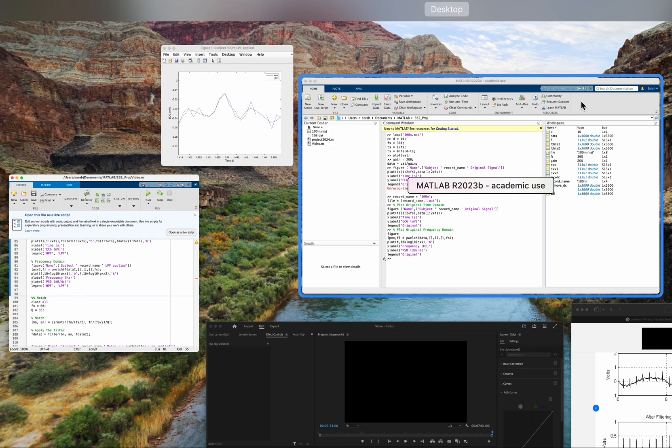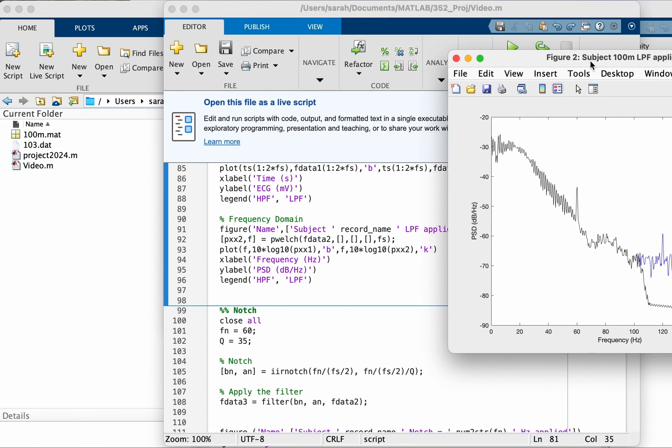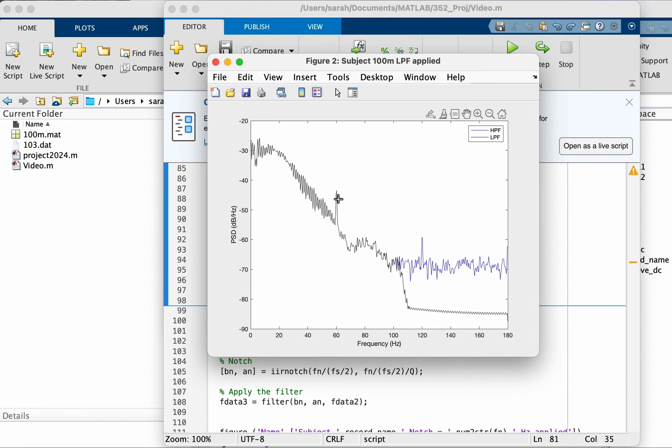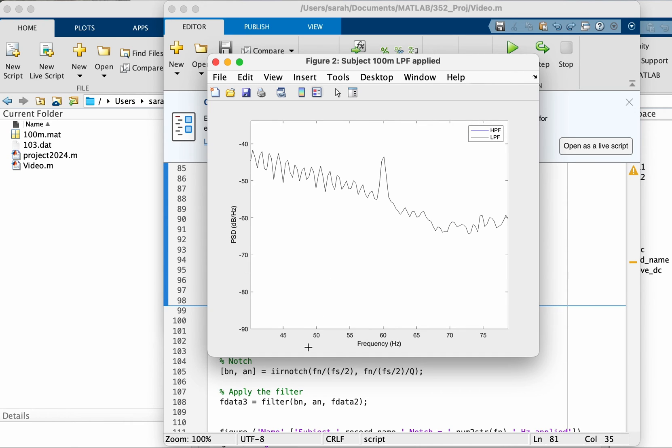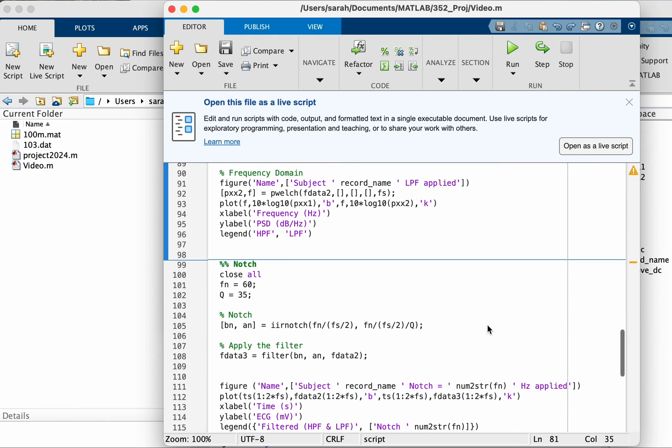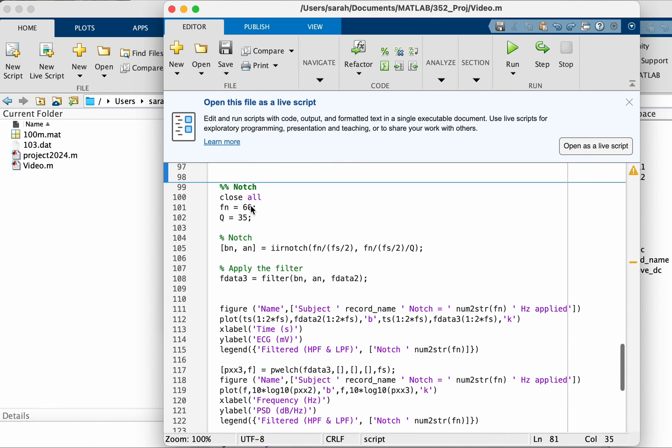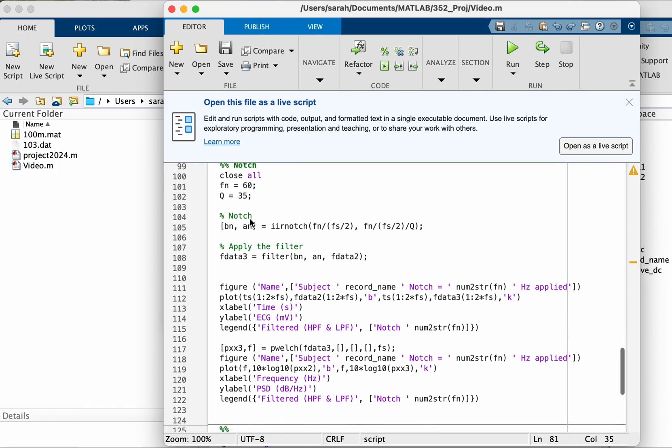Now if you look at our frequency domain, we can see one issue still remains which is the power line interference here at 60. So we want to remove that. How do you remove it? We use a notch filter and we choose the notch frequency at 60.